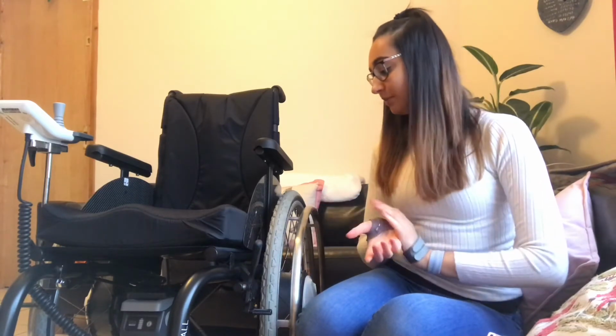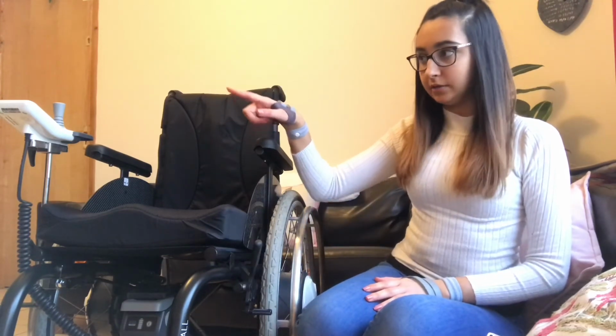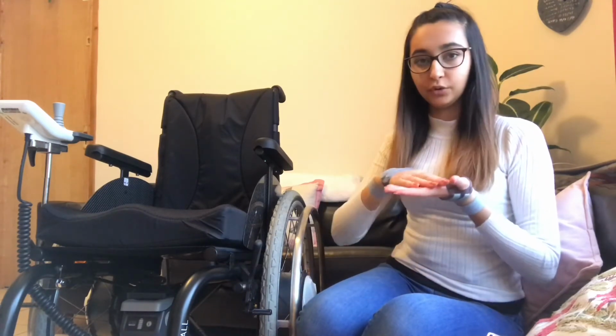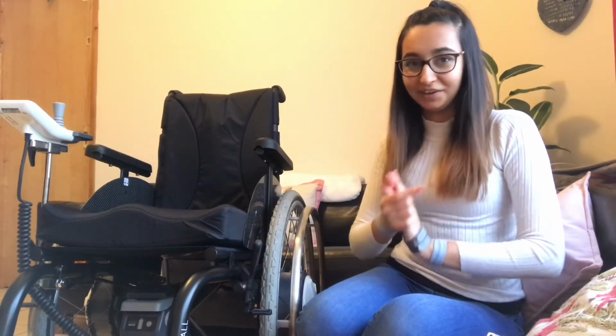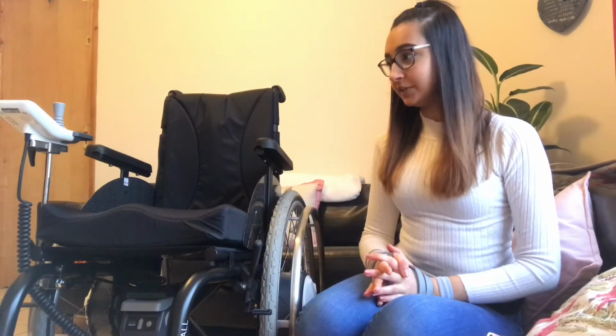So with my experience with it, I would say the chair does amazingly on uneven surfaces. It can go up and down hills, and the speed calibrates to whatever hill you're on. So you set your speed using the device, and then if you're on a hill it will recalibrate so that you're still going at that speed, and if you're going downhill it does the same thing. I found that really helpful, and if you were to stop on a hill, the brakes would just hold you there. You're not going to go sliding up or down a hill. So I think those were the main features.